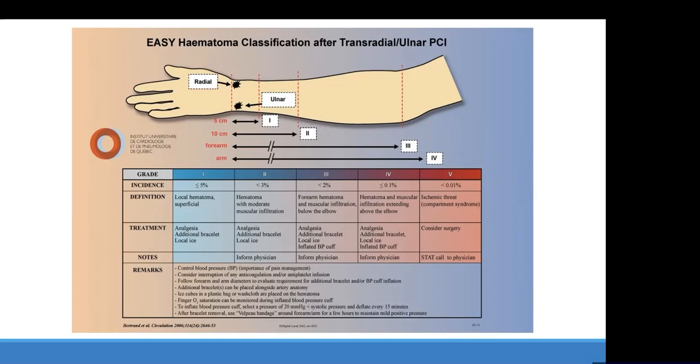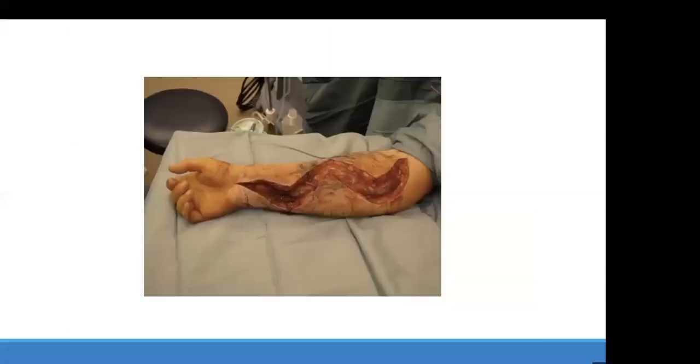But when I saw it, it was so scary because first, this is the biggest hematoma I've seen in my life. Number two, I'm sure that there was a compartment syndrome. Number three, there is no vascular surgeon on site that can help us to evacuate that hematoma underneath the fascia. This is how it looks after the fasciotomy.